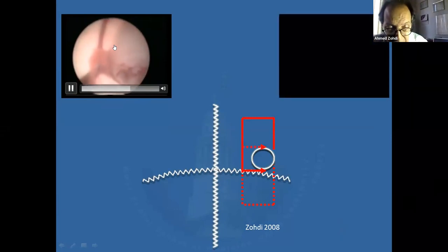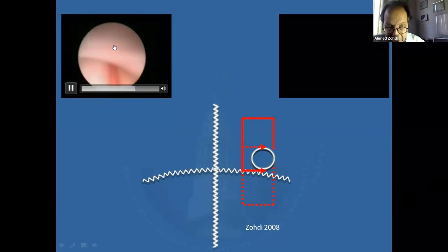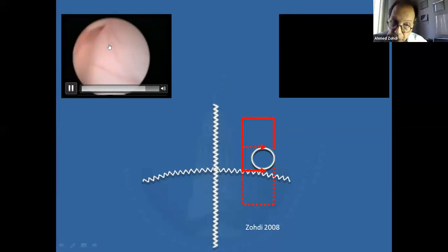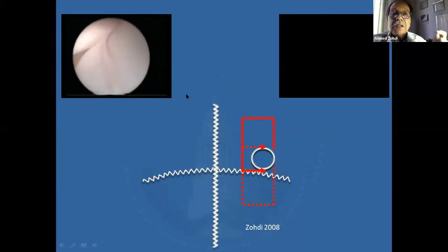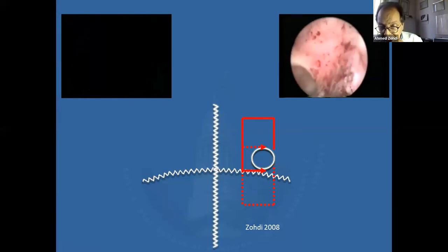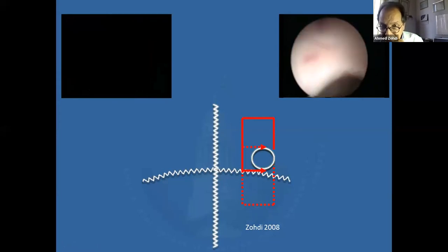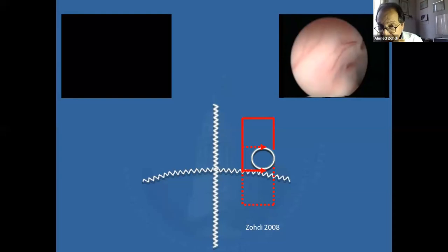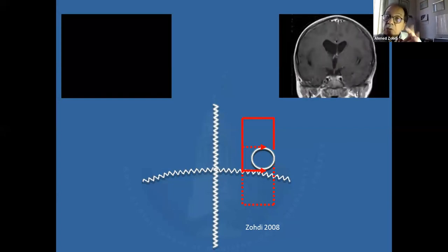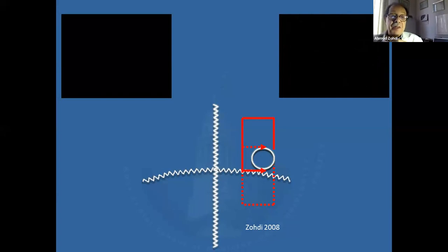And with the Kocher burr hole, you can always say, well, I will go anterior or I will go posterior, and still be in a safe place, and do the actual excision of the tumor. As you can see, it is just lying on the foramen of Monroe. And I will tell you now, and I'll show you, why the endoscope is also needed. Because as we did this, and we finished, and we shaved it from the lateral wall, we went in with the endoscope again to inspect. And very interestingly, as we went into the third ventricle, we found a sort of seeding, an ulcer from the tumor. Although it proved to be an astrocytoma grade 2, it did change the management, from only leaving the patient for a wait and see follow up to more of an adjuvant therapy thereafter.